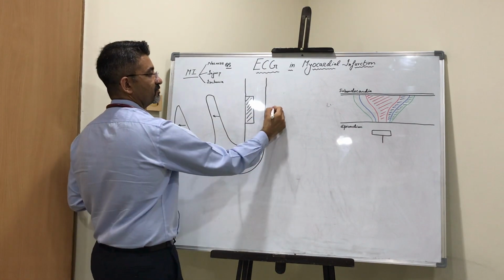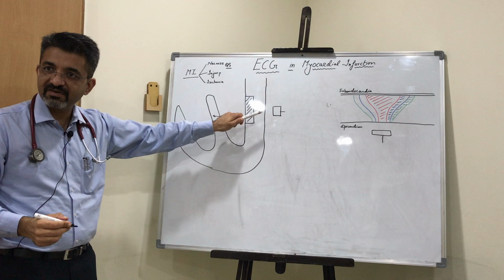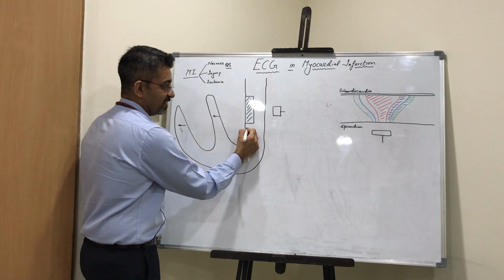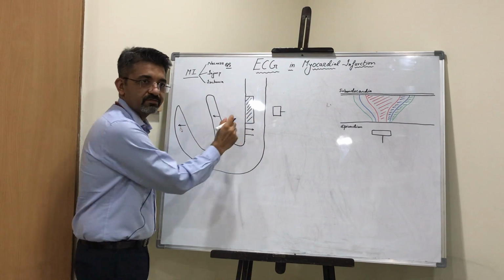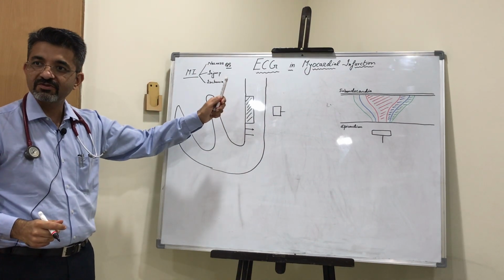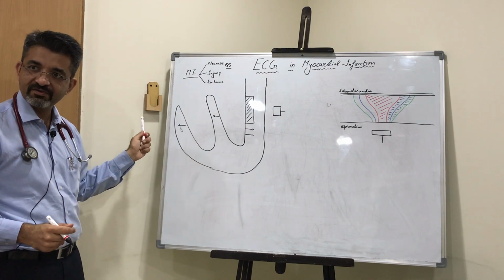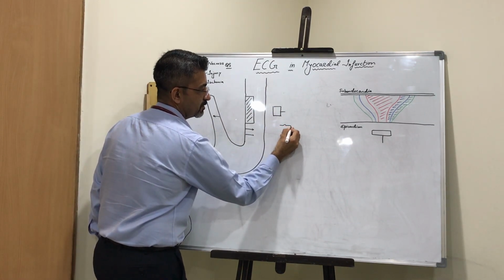I have a lead here. If it had been a complete infarction, then there would be an electrical gap. Now there is not a complete infarction. So what will happen is, as soon as this normal muscle starts activating, this won't. If it is not getting electrically activated, this will sense something going away. So there will be a Q wave formation.